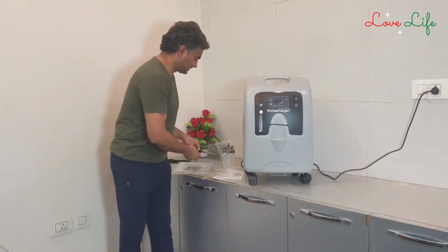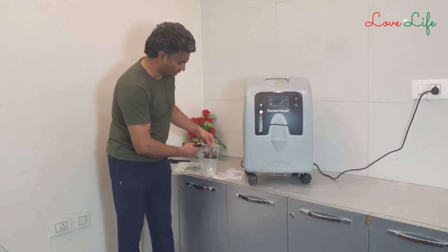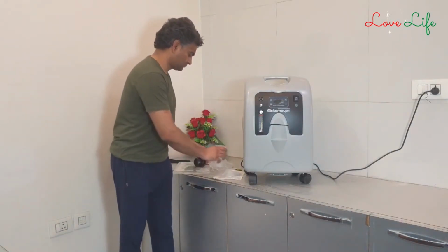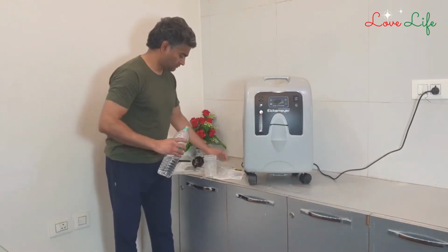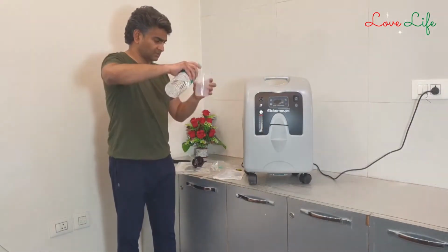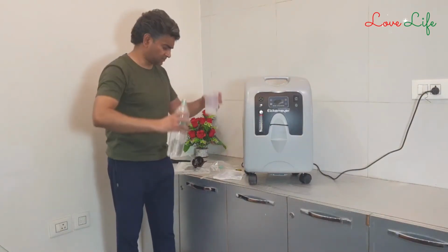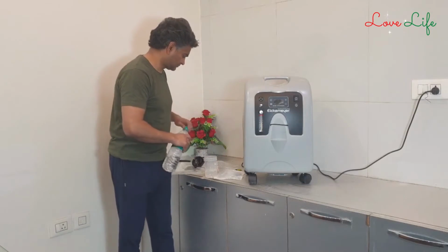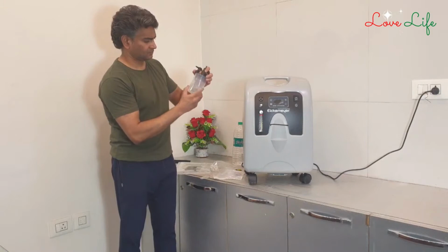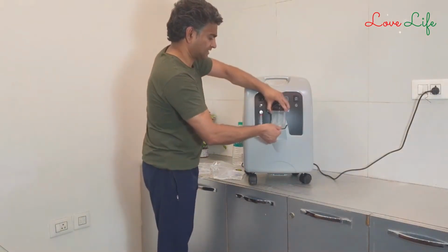So let's install the device. First we need to fill the water in this bottle. There is a maximum level, there is a minimum level. So we will put minimum, probably. That's okay. We'll fix it here.